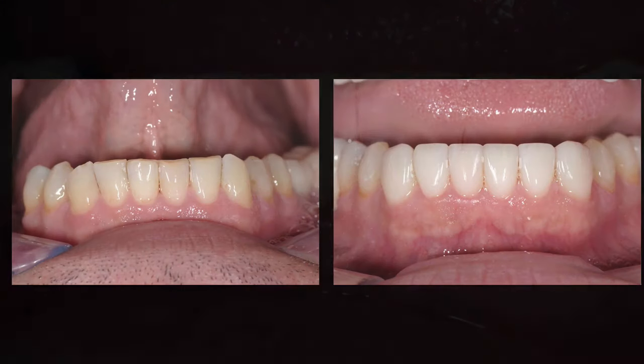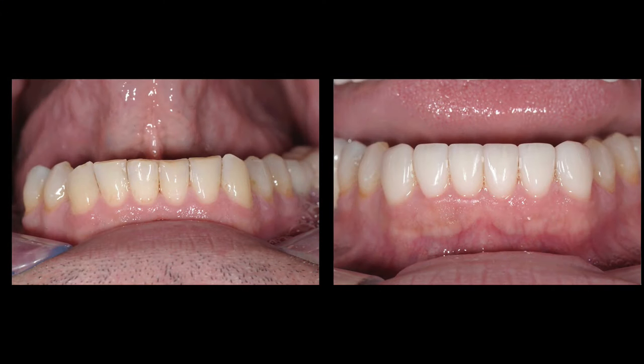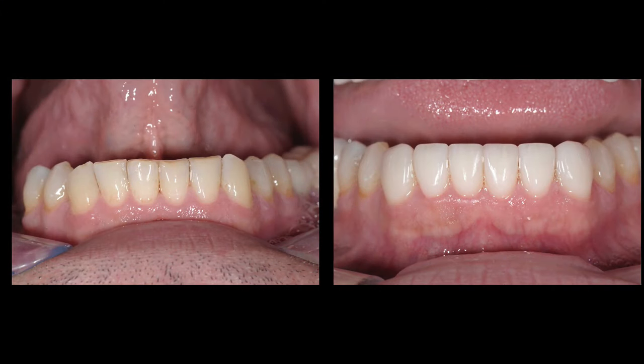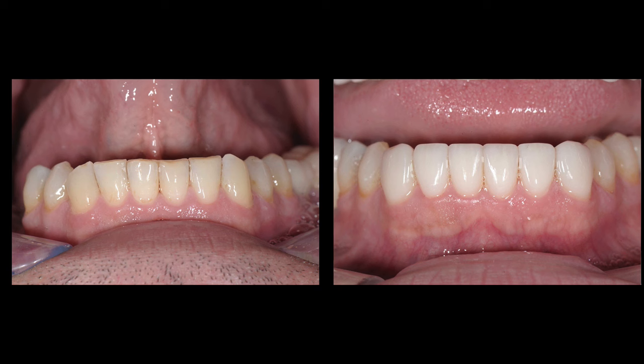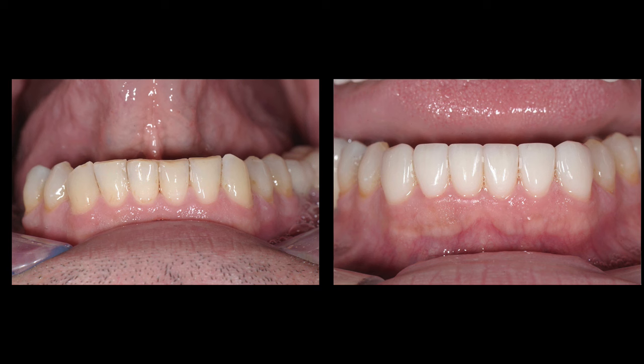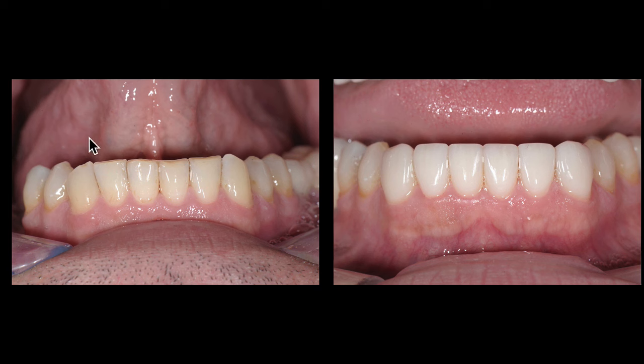If you look at this case — one of my favorite cases from the last few years, I've shown this on a couple of different seminars — we changed the lower veneers to improve the guidance and the occlusion. We also added some posterior implants, and this case is holding up exceptionally well.